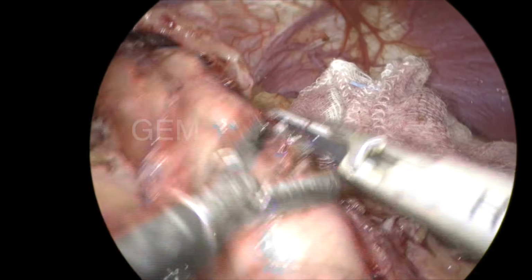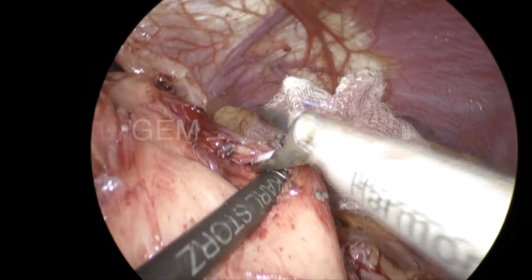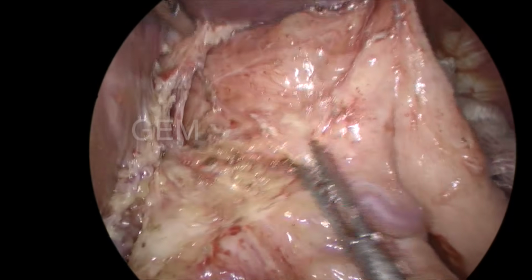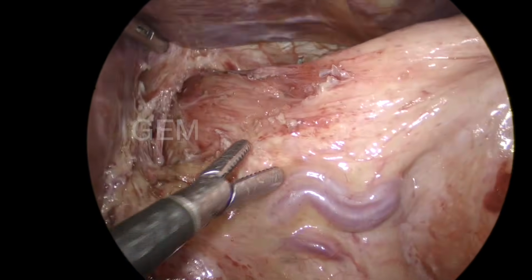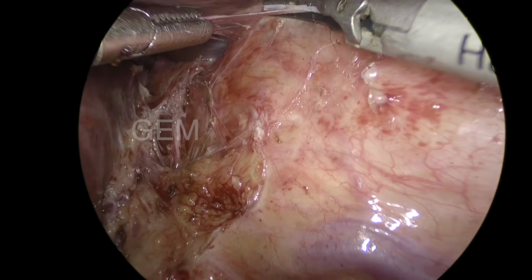You can see now, with the left hand I dissected, I confirm it's only the fibrous tissue, then I divided. Again, I am coming on this side. Can you see this type of tissue is there?